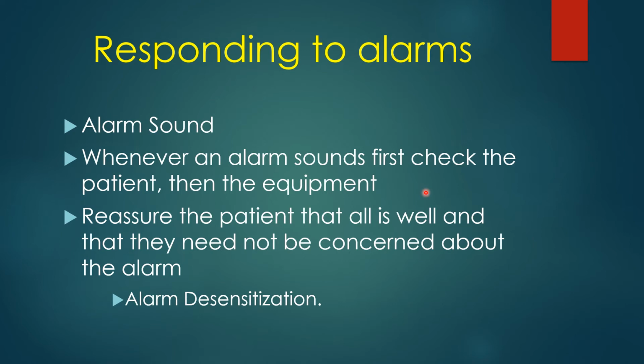Is the cuff blown, or whatever the reason is. And then you work from the patient, and you might listen to the patient's lung sounds also with your stethoscope while you're there. But you check the patient, that end first, and then you look at the tubing, make sure all the connections are tight, the humidifier, back to the ventilator, and that's the way you're supposed to do that check.